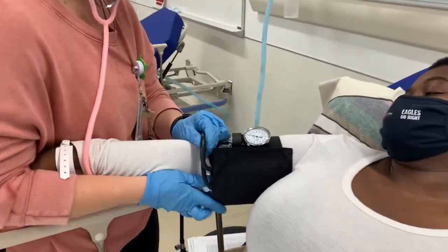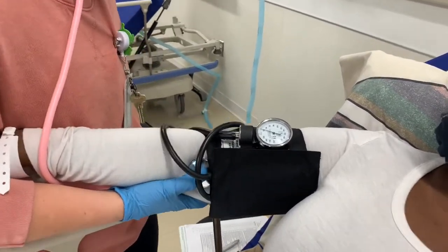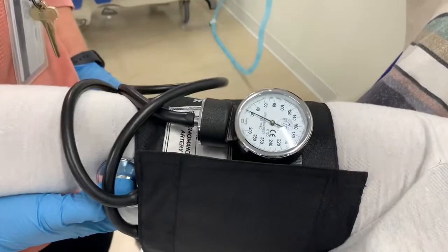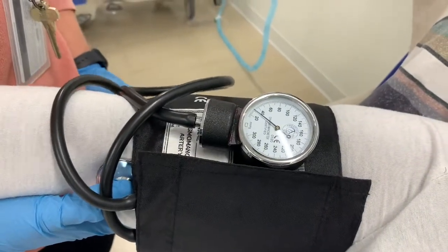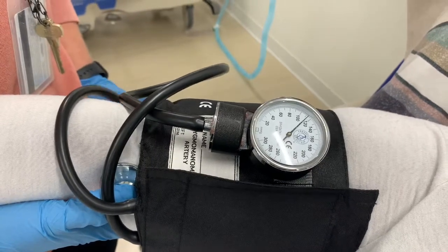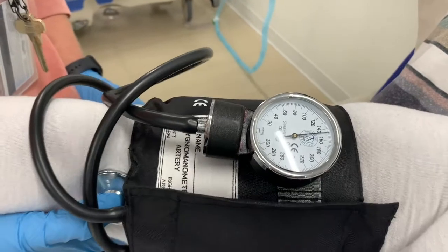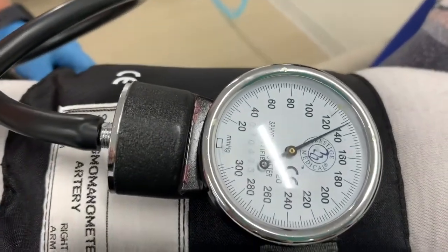Measure the blood pressure during inflation. Measure the blood pressure during deflation.